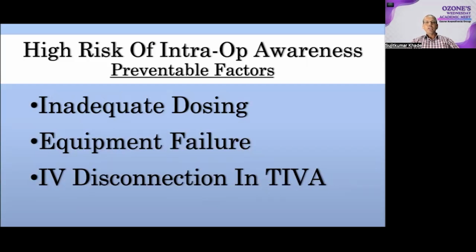And I have already shared the case of intraoperative awareness due to equipment failure. So equipment failure is another cause. Apart from improperly fitted vaporizer, which I have shown the picture, there is also increased risk with empty vaporizers or if there are errors in the gas flow. Anesthesia gas monitoring is very useful to know the correct delivery of inhalation anesthetic agents. In TIVA cases, IV line disconnection can cause intraoperative awareness.